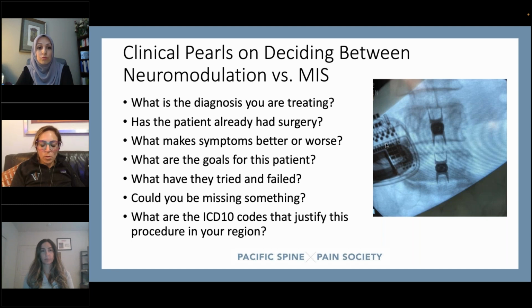Jill, you spoke really beautifully about peripheral nerve stimulation. I tend to think about those patients too, specifically for my patients with upper extremity shoulder issues. So you talked a lot about knee, but we have DRG, and some patients may not want an implantable device for their lower extremity. But for a lot of upper extremity patients, shoulder patients, things like that, peripheral nerve stim is a great option because DRG is really not indicated for that high. And though a lot of people are using it off label for higher levels now, for those who aren't, or in practices that don't have access to that, understanding what you can and can't do for those patients is great. So those are some brief clinical pearls.